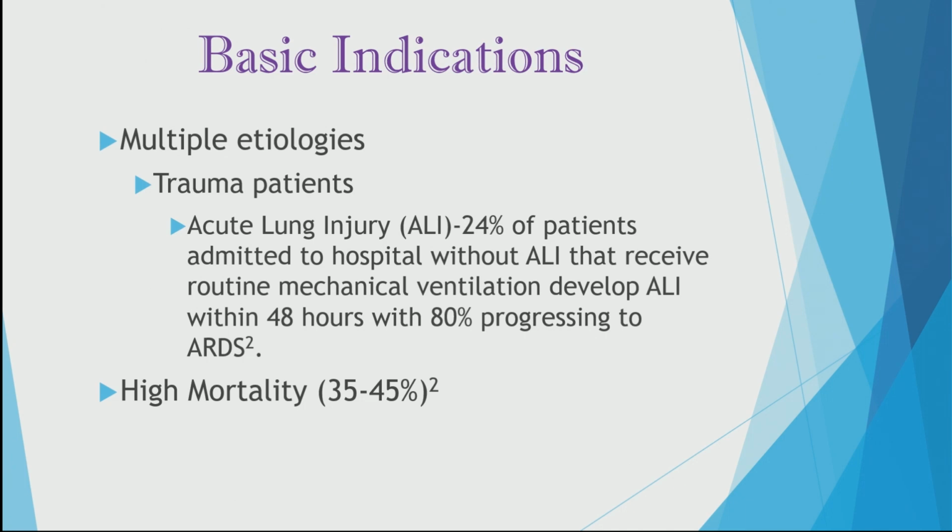Now, before we move on, most people ask, does APRV, this mode of ventilation, statistically reduce, and that's the key word, the mortality rate of patients who have ARDS?